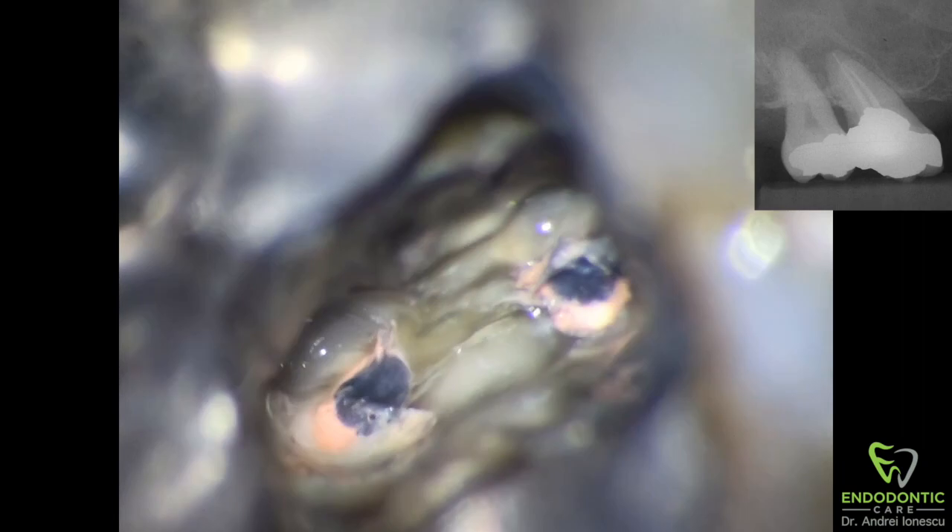You can see that the previous dentist treated two canals. The one on the left is the palatal canal and the one towards the right is most likely the mesial buccal. If you look on the floor of the pulp chamber between the two canals you can see a developmental groove. Now the question is — there should be a third canal on this tooth. Given the fact that the root is so conical, I think the distal buccal canal will most likely be very close to the mesial buccal. So let's start removing these carriers first and then we'll figure out where the third canal is located.